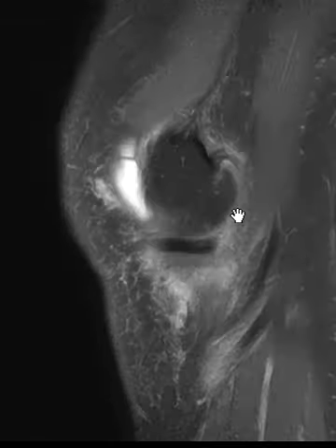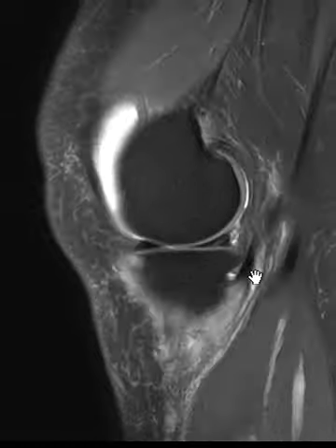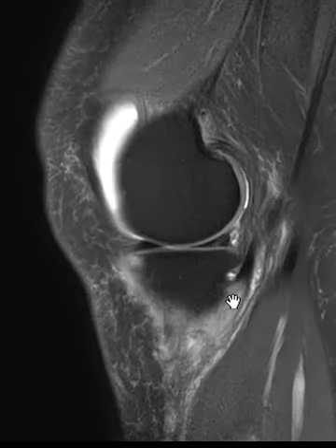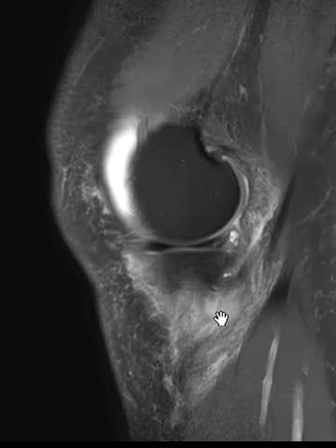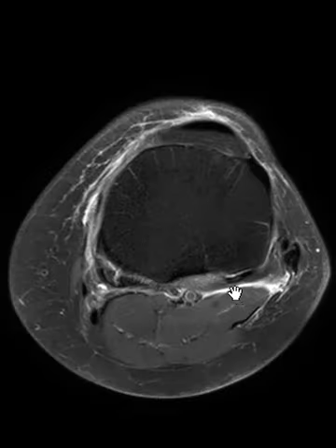We'll put up another view here to verify that. Here we go. Here we see the tendon coming down. Some of the fibers attach okay, about right here. But over here you see them torn, thickened. They peeled off a little bit from the tibia. So this is a semimembranosus tendon tear, a partial tear.